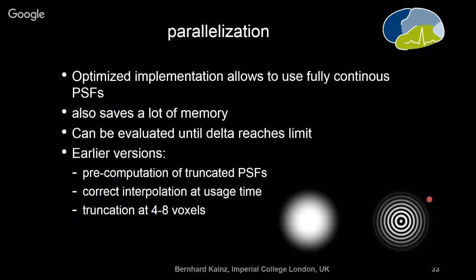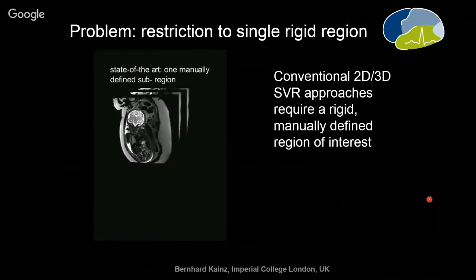As I said, we don't use just simple interpolation kernels. We have point spread functions. These are actually measured from the scanner, so they are quite comparable across scanners, but if you do it specifically for your scanner, then the results improve a little bit structurally and the edges improve a little bit, but the general idea is you don't use a simple linear interpolation kernel.